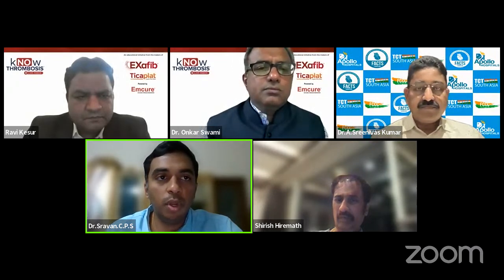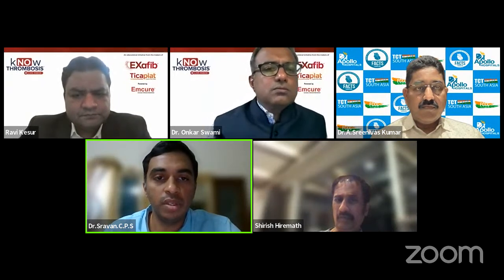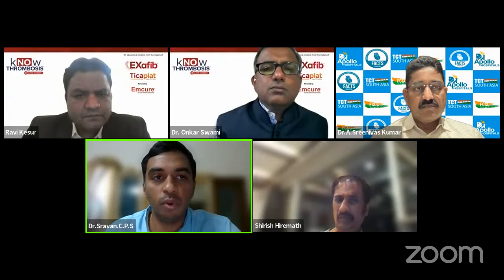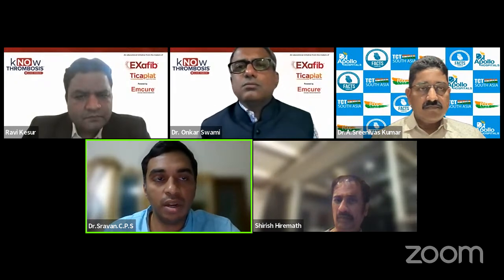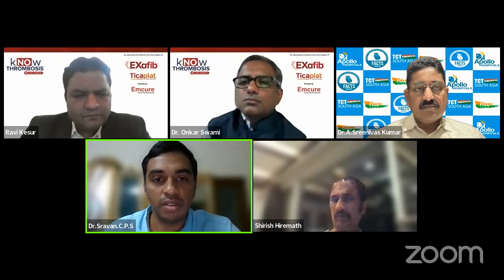Yes, sir. Now, one thing good from Penumbra is, sir, they are coming up with 12 French and 16 French devices, which are available in the US. And they also have something called the Lightning system, sir, which is like intelligent suction. Here, our issue is we sometimes don't know whether we have engaged a clot or it's an open vessel causing free flow. But Lightning has an inbuilt chip which will automatically detect that we are in free flow, and it will automatically shut down the system and stop the suction. So according to the company, it should be available in the next 6 to 8 months in India. Once that comes, our blood loss will also be less, and because of a higher bore of 12 French or 16 French, our results will be even better and faster, I guess.